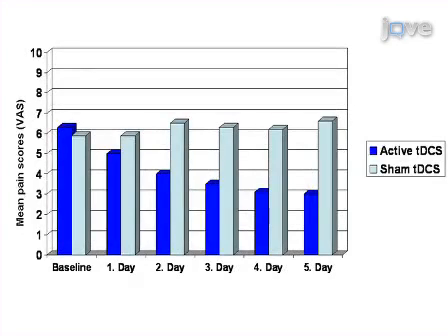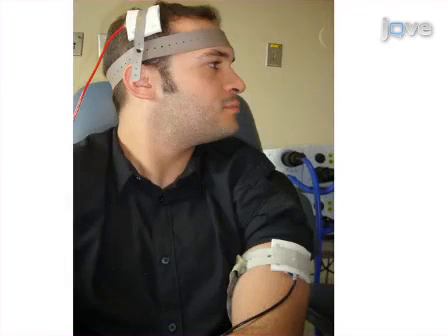With session duration of 20 minutes or more, and with multiple sessions over consecutive days, the after effects of TDCS are longer lasting. An example of this is the treatment of pain syndromes. One important point is the location of the reference electrode. If an extracephalic position is chosen, the investigator should be aware of current distribution, as the reference electrode might displace the peak of induced current and modify the effects of TDCS.